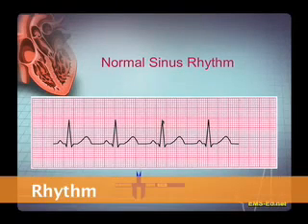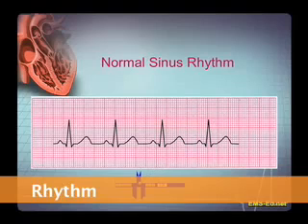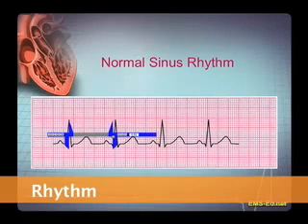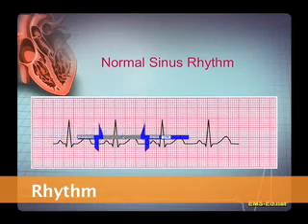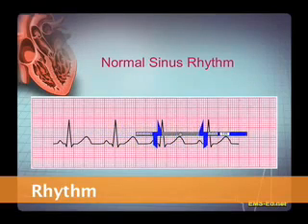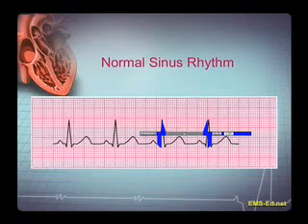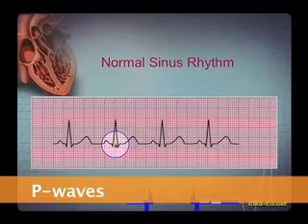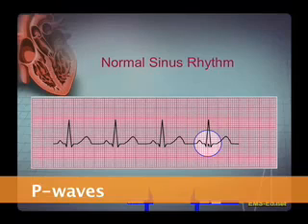Now let's look at the rhythm. Is it regular, and how would we know? We measure the distance between R waves. It's about four and a half big boxes between R waves. Using calipers, we measure from one R wave to the next, and successive R waves appear to be about the same distance apart. Therefore, the rhythm is constant. Now let's look at the P waves. Do we have a P wave for each QRS? We see a P wave and a QRS, a P wave and a QRS, a P wave and a QRS — yes, there appears to be a P wave for every QRS and a QRS for each P wave.